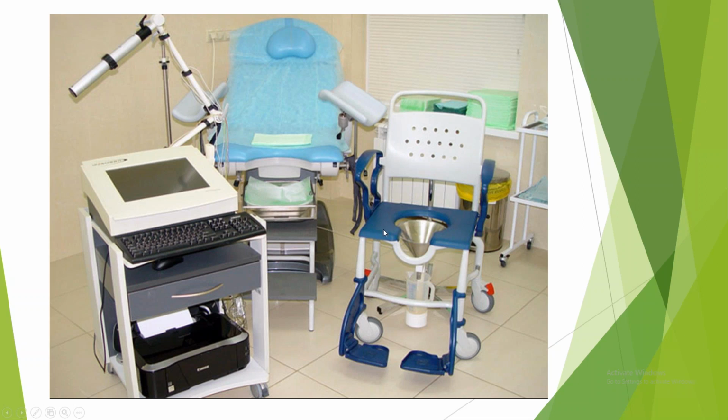So this is the chair for the uroflowmetry. Here the patient will sit. The first component of urodynamics will be uroflowmetry, that is, the patient is asked to void on this uroflowmeter. Here is the container. It is the rotating flow meter. This flow meter will be rotating, and the volume and the speed of the void will be measured in this container. So this is the part for uroflowmetry.